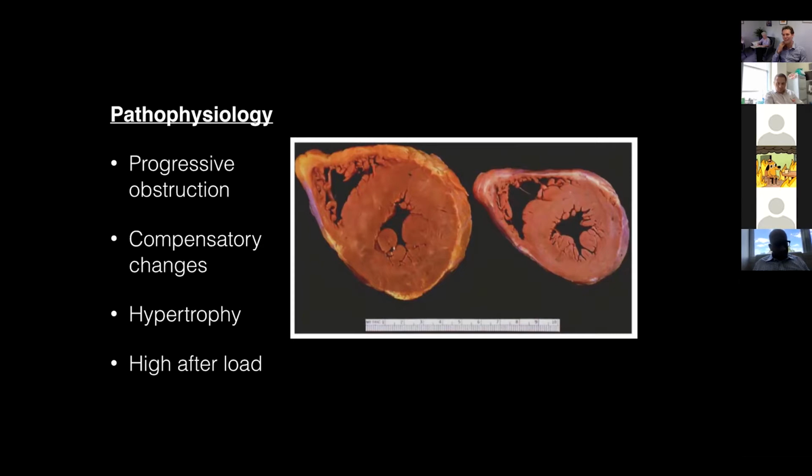I don't know if any of you had a chance to look at Faraz Pathan. I've called it reporting with the legends, and we went through a case of aortic stenosis with Faraz, and I put it on our website, but I learned a couple of really important things in there. One of my favorite comments from Faraz was him saying that the parasternal long axis view is a really good view to tell you things that can kill a patient, and it's also the view that embarrasses people reporting echoes. I have, for example, thought that someone might have had severe aortic stenosis, but they had perfectly normal myocardium, and that doesn't really go together. If you think you've got significant stenosis, you're going to have some form of hypertrophy.